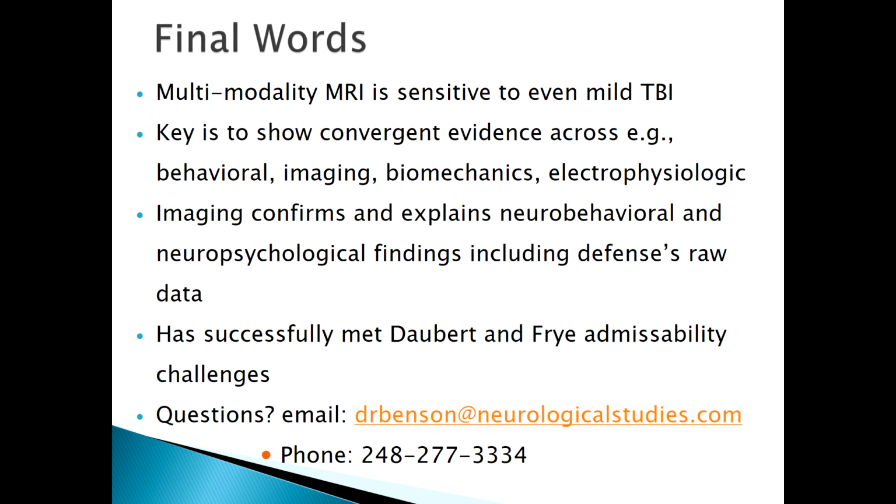I think it's likely that spectroscopy could be sensitive, and I think it's likely that perfusion could be sensitive in the first 24 hours. We don't know about DTI, and I think it is less likely that SWI would be positive. Hopefully this has been helpful for you.